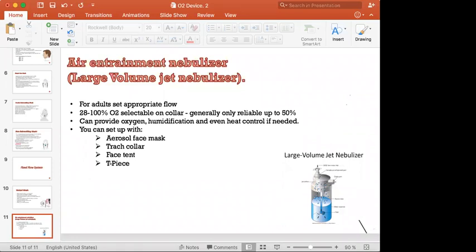It's very helpful for desaturating and severe hypoxemia patients, if the patient doesn't need, of course, intubation and mechanical ventilation. Sometimes they extubate the patient and put him on high flow nasal cannula because the patient has low flow and some hypopnea or hypoventilation.